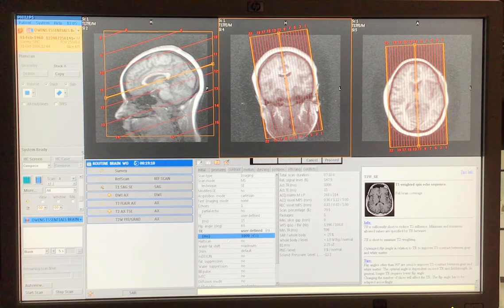Right, okay. Well, what I want you guys to know, okay? I don't want you at all to worry about your scan time yet, okay? Because we're gonna eat this elephant one bite at a time here. So however you manipulate these numbers, don't necessarily worry about the time yet. Because at some point we're gonna say, nah, that's too long of a time. What else can we adjust to make it a quicker scan for that patient to lay there, okay?